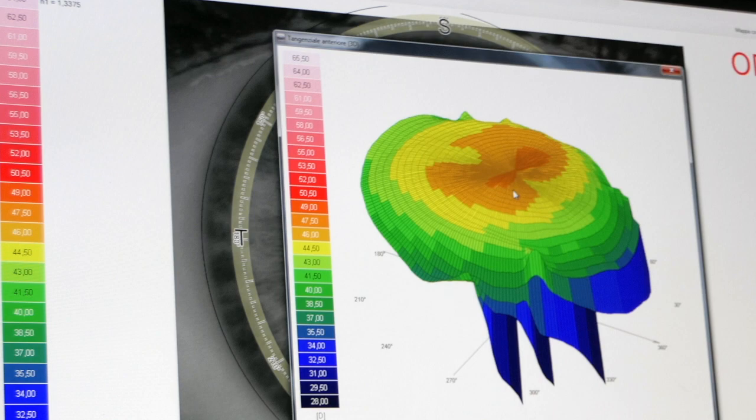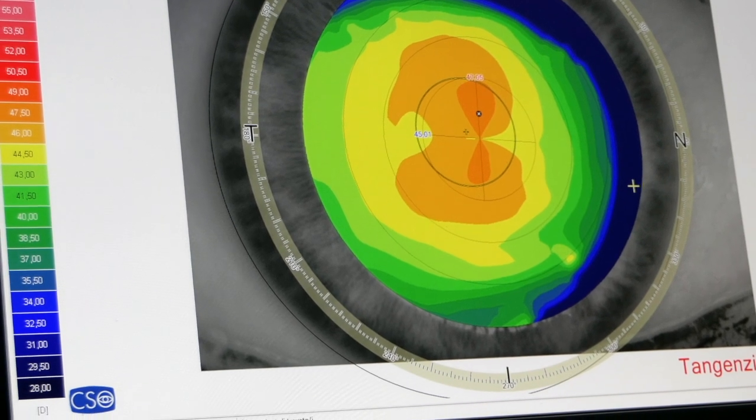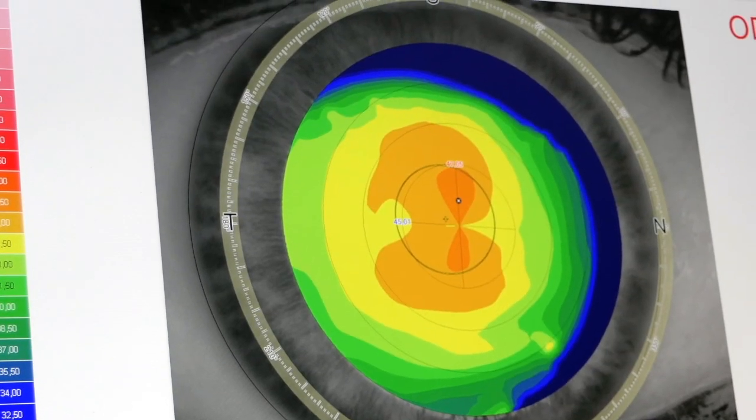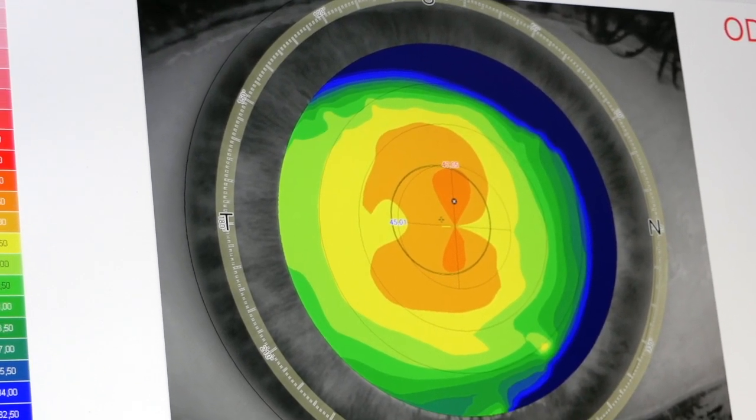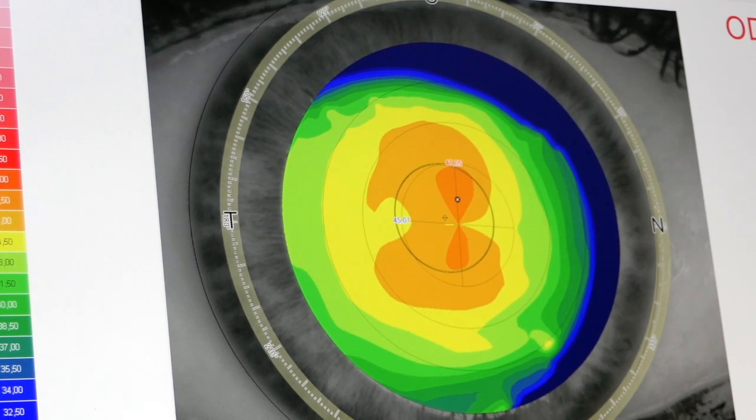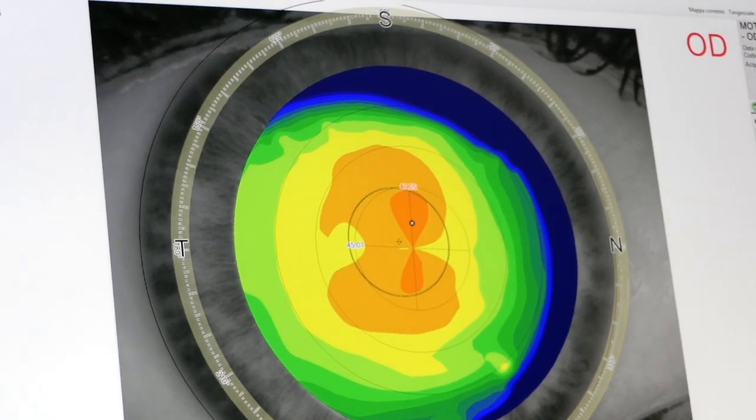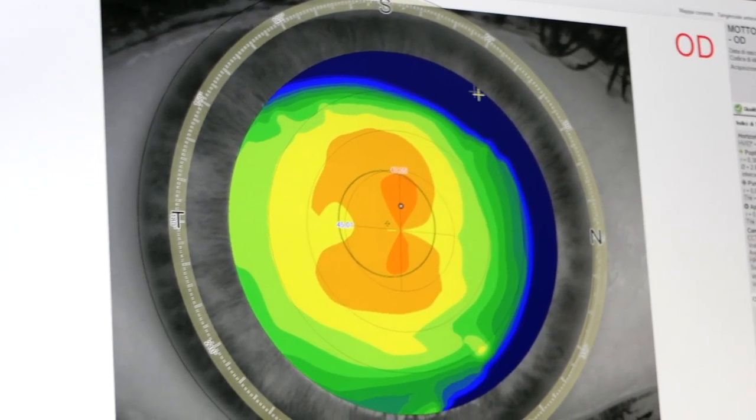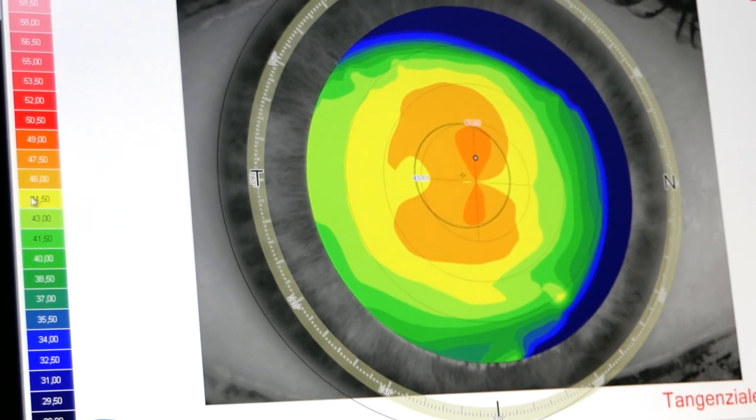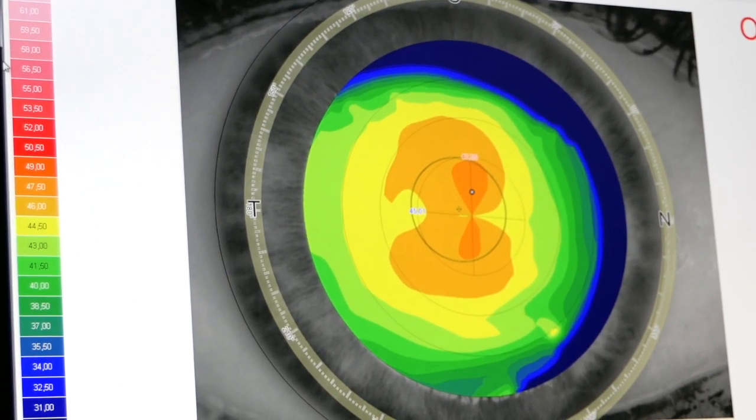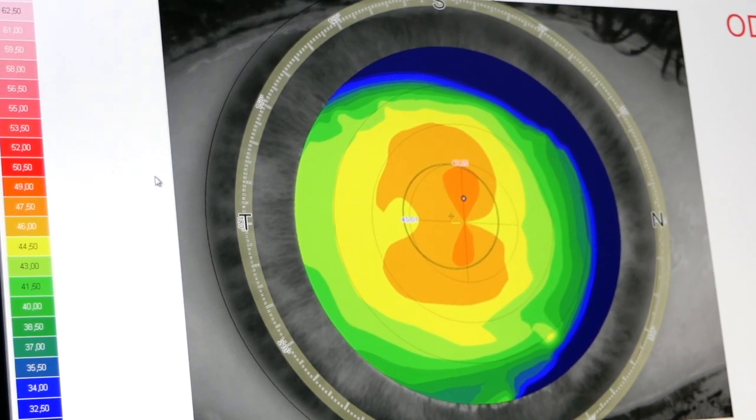The corneal topography is expressed in diopters. Here on the left, the color scale is represented in which there are the coldest colors that show the flattest part of the cornea. The intermediate colors represent the intermediate part, and the warmer colors represent the most curved part of the cornea.